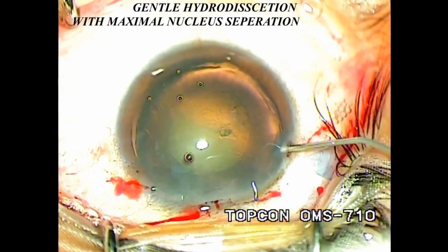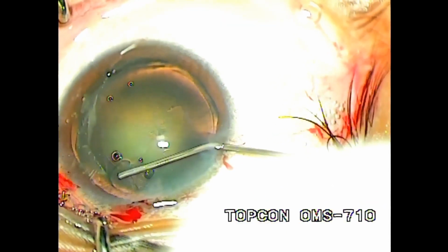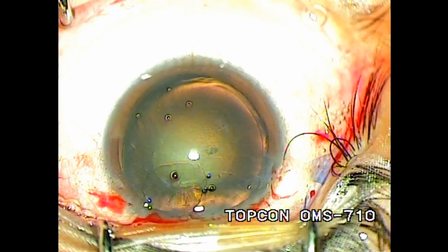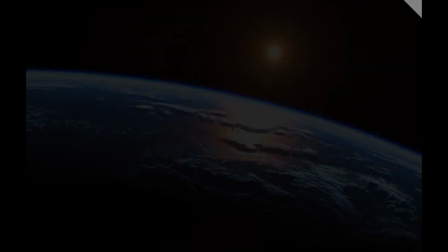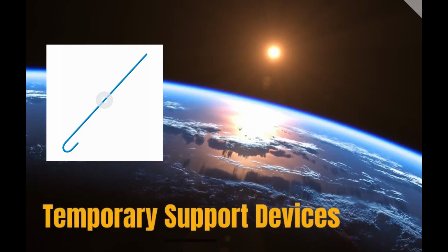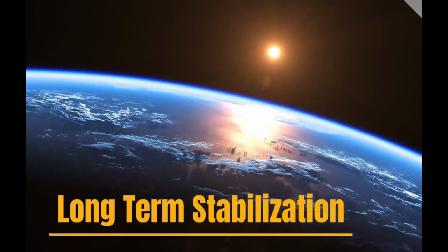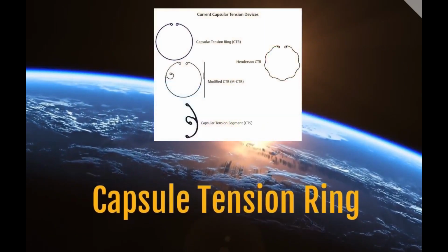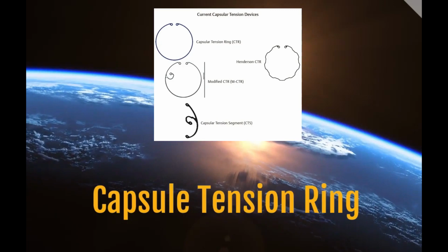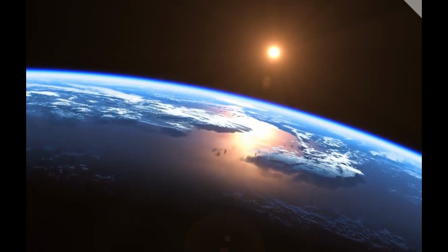Once the capsular rhexis is done, we are moving on to the hydrodissection. A gentle but thorough cortical cleaving hydrodissection should be performed so as to free the nucleus maximally and lessen the stress on zonules. The capsular support devices are used during surgery for temporary and long-term stabilization of the capsular bag. Temporary support devices include iris hooks and capsular hooks. For long-term stabilization, we use capsular tension rings made of polymethyl methacrylate for cases of mild to moderate zonular weakness. It can be inserted at any stage following capsular rhexis.